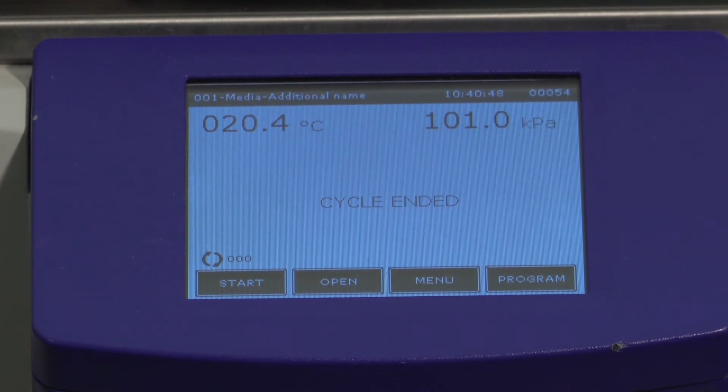This system would be programmed to have either a standard media cycle that is going to be rising to a sterilization temperature for the specified amount of time, then it would cool down to our holding temperature, and then we would be ready to dispense. Then we have media plus additives, which would have a stage screen that would allow us to go to a certain stage temperature, where we would add our components and then move forward with the cooling process down to the finished dispensing temperature.